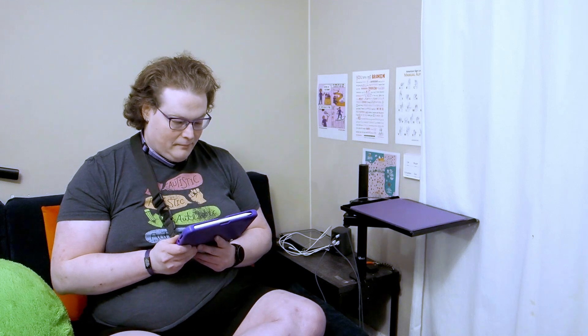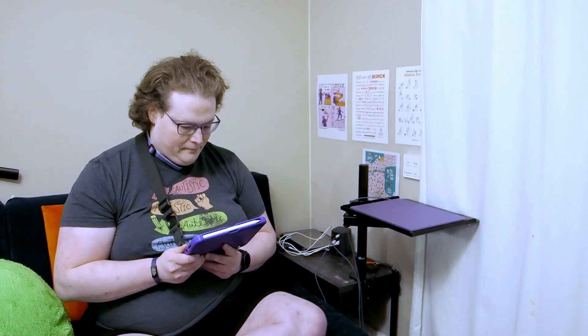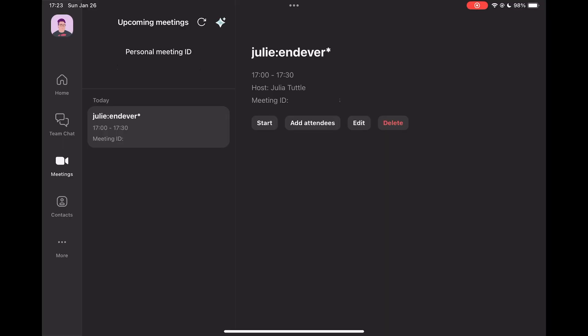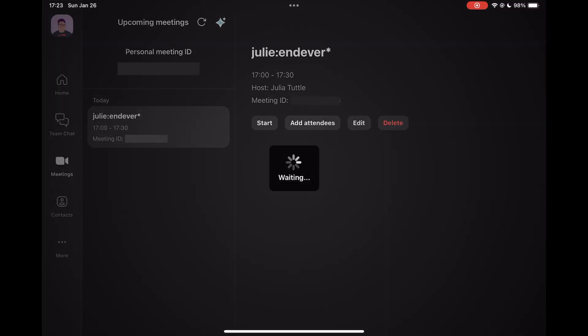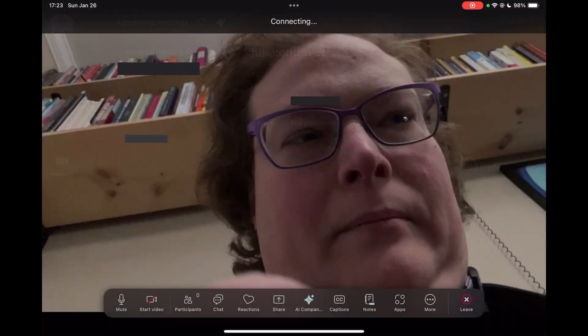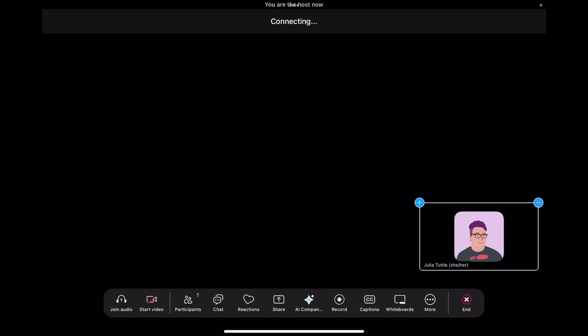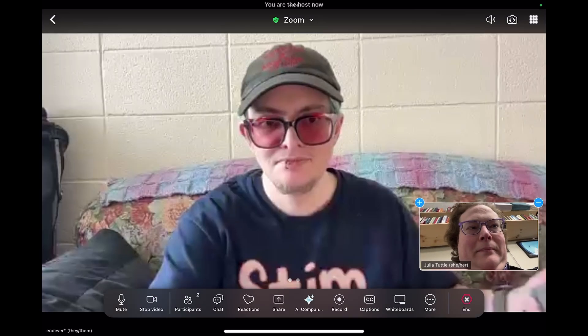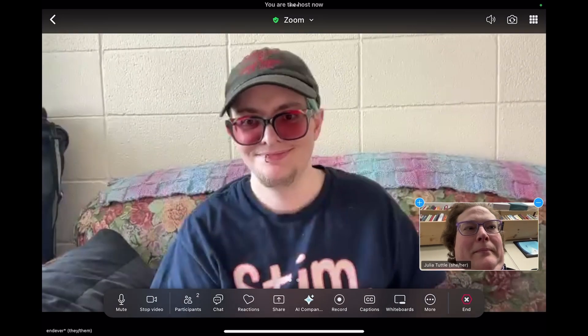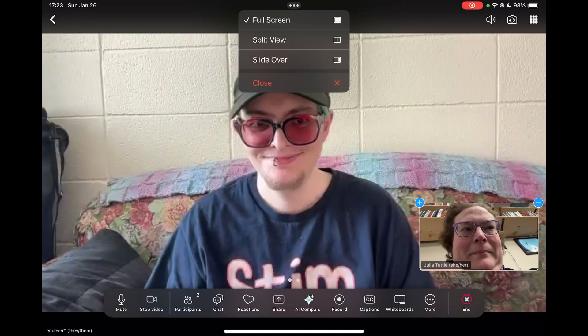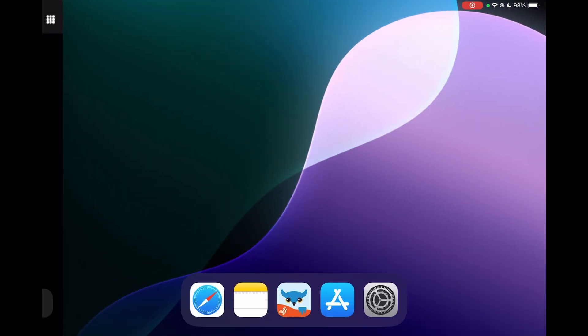Now, let me open Zoom and call Endeavor. Once we're connected, I can switch back to Proloquo full screen, or I can split my screen between Zoom and Proloquo.